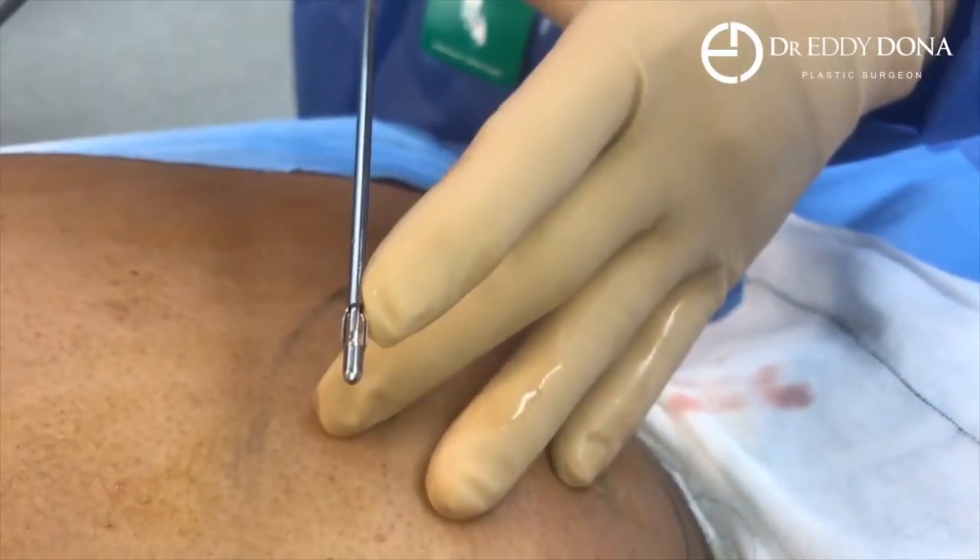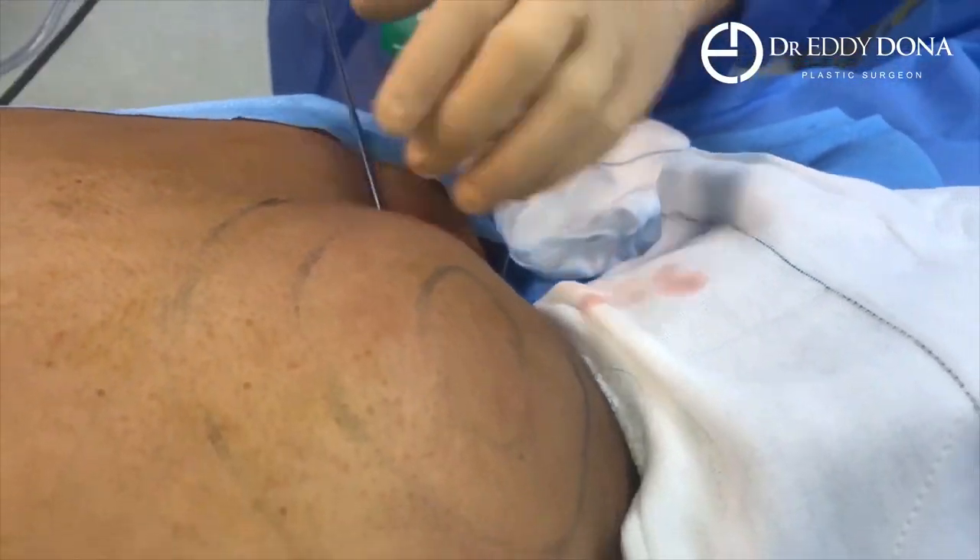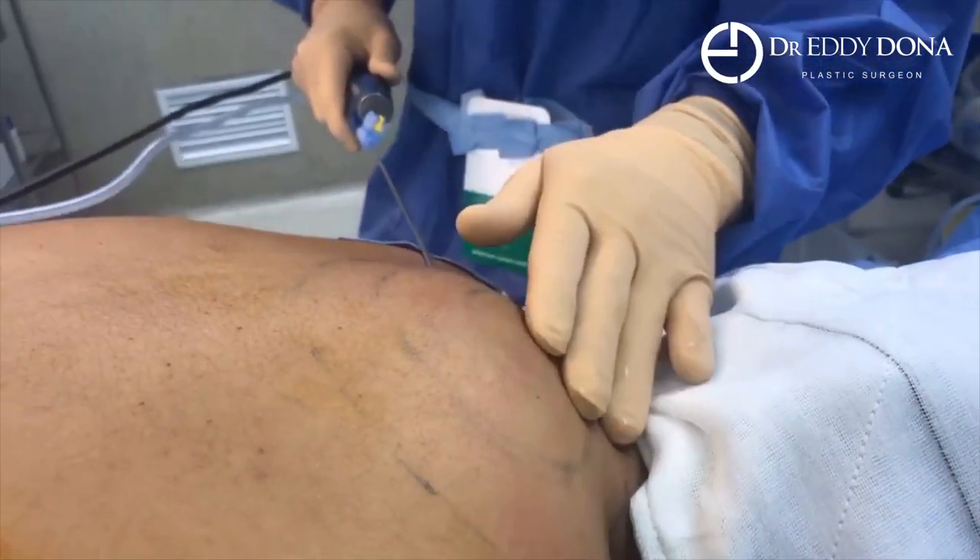That's the cannula tip that we're putting in for the liposuction to break up the fat — the little basket tip — and we use it to break up the fat.